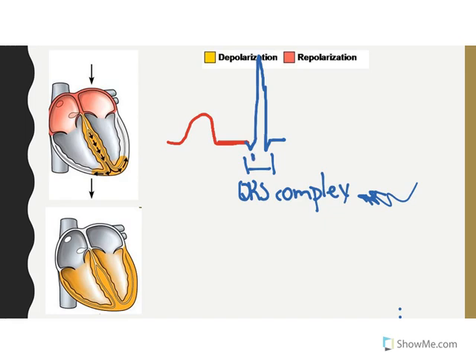This Q wave, this small one right here, represents depolarization of the interventricular septum. The big R wave, which you see here, represents depolarization of most of the muscle fibers in the ventricles, starting from the apex, moving on to about here. So we see a fairly large waveform. A lot more muscle, you're going to see a lot more electrical activity associated with it. This S, which is this small downward deflection, is depolarization of the muscle fibers near the base of the heart. So collectively, the QRS complex represents depolarization of the ventricles.